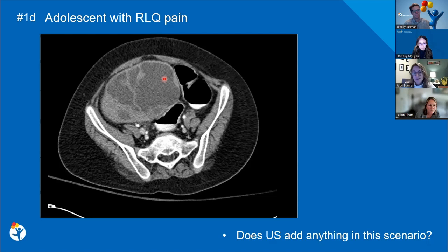Now, maybe this is jumping topics a little bit, but if I'm going to recommend that a cyst or some sort of funky lesion goes away, then I'll say get the ultrasound in 6 weeks for the follow-up. But in the immediate setting, I don't feel like it adds very much. If the patient has pain, there is a known lesion, or it's torsion, it's not going to add value to the care of that patient most of the time.